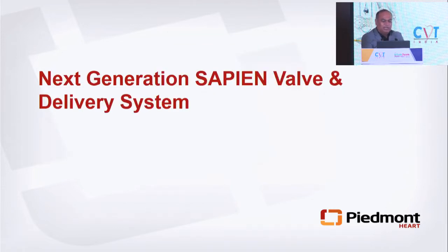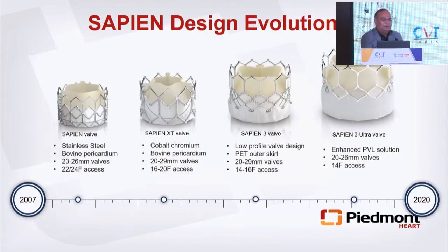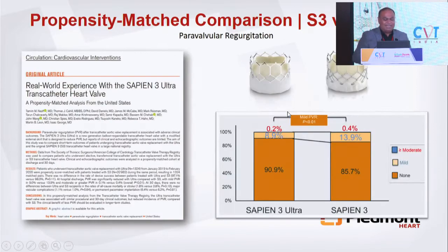So with that note, I'll show you the next generation of the Sapien valve. These are the valves that we're using right now in the US as commercial, Sapien 3 and Sapien Ultra. I think here we're using Sapien 3. The difference in Ultra is the skirt, right? The skirt is taller as compared to Sapien 3. And what that did, it's already commercially used in the US, and what Ultra did was reduce that mild PVL from about 14% to around 9%.